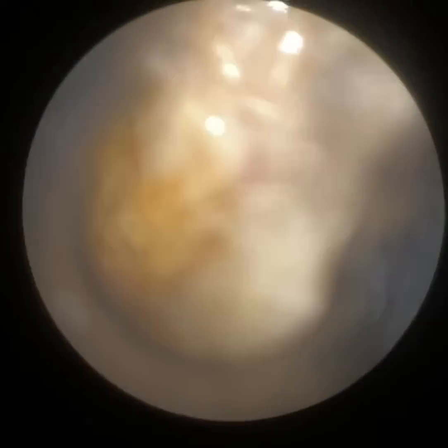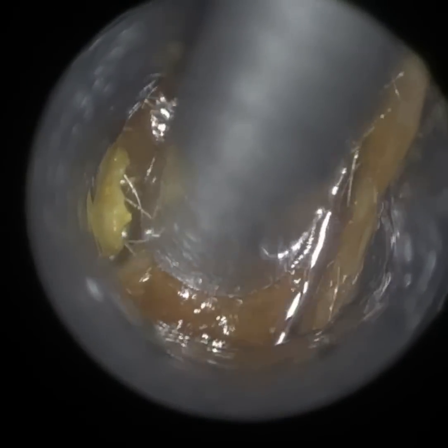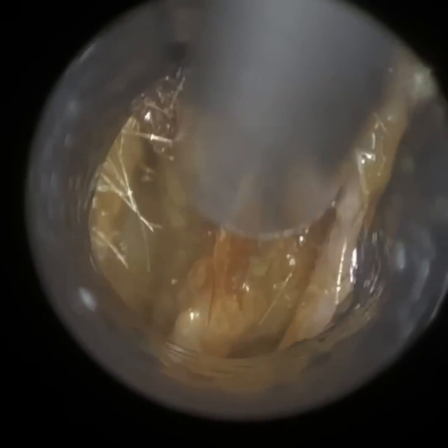That's the left ear, and this is the patient's right ear. This right ear was slightly narrower. I put some olive oil spray immediately because the consistency was the same as their left ear — you can see that oil there, it's glossy in appearance. I'm using our 4.25mm speculum here — that's going to be our standard size. We also have a 3.5mm smaller speculum, a 5mm for larger ears, and a 5.75mm which would be more useful for mastoid cavities and enlarged ear canals.